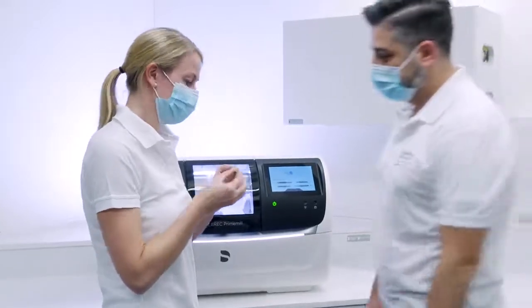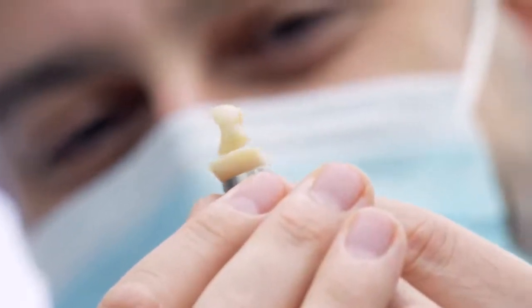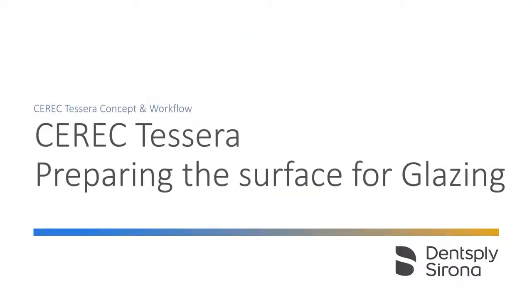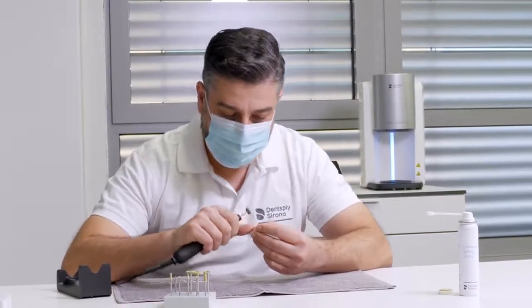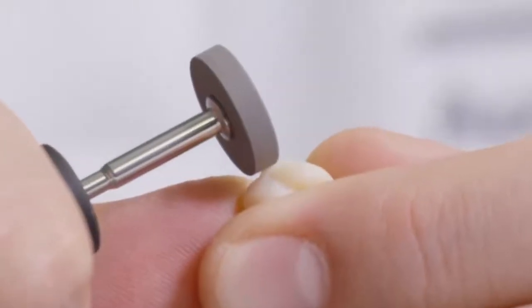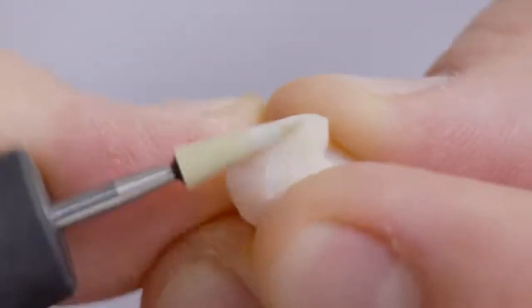After a short milling time, Cerec Ticera already impresses with its marginal stability, obvious opalescence, and translucency. After removing the crown from the machine and separating it from the residual material, the sprue is first ground with a heat dissipating diamond coated stone. The surface can then be smoothed with a finer stone.